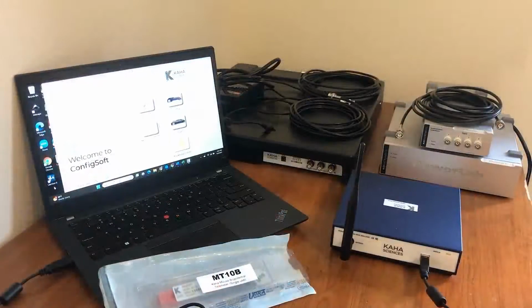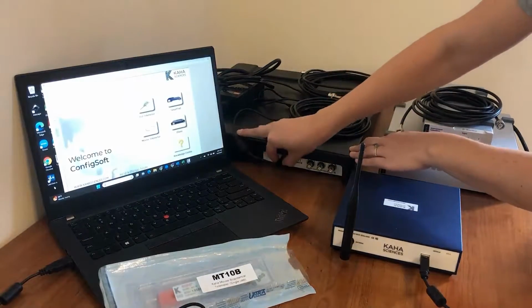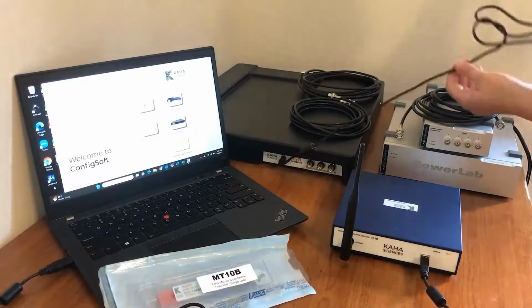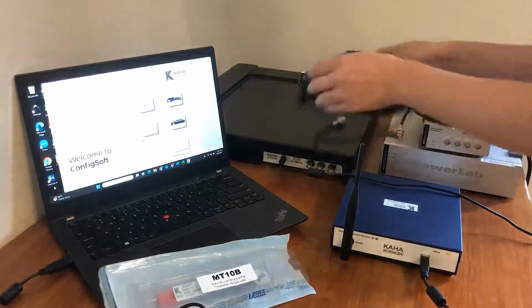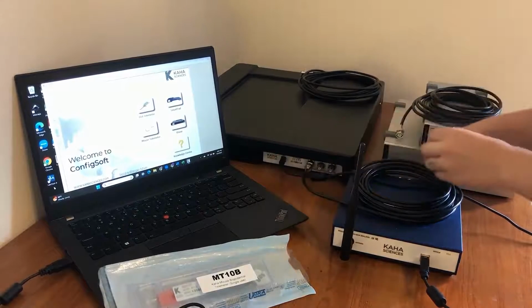Next, we will set up our tBase by plugging our power supply into the back of the base. This other end will of course plug into a wall outlet. Next, we will connect the BNC cables from the outputs on the tBase to the inputs on the instrument interface.